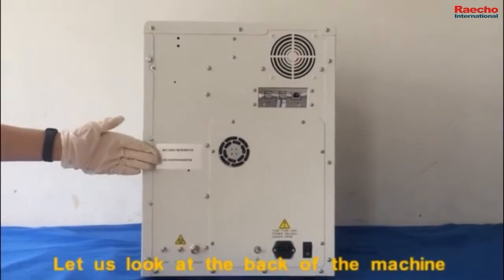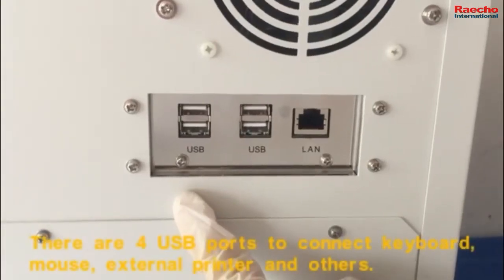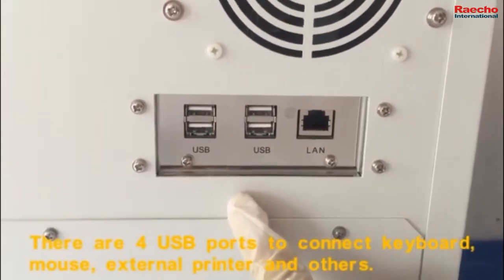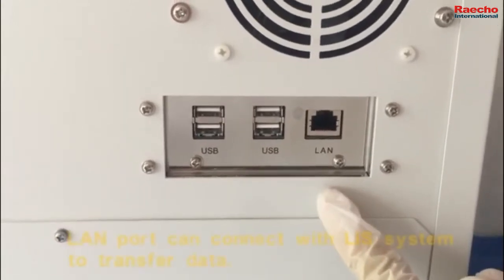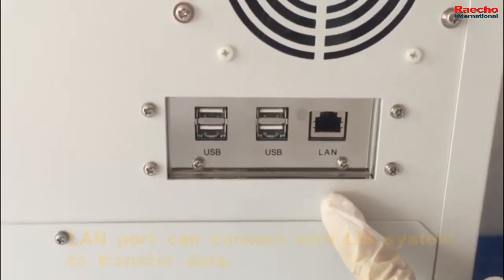Let us look at the back of the machine. There are four USB ports to connect with a keyboard, mouse, external printer, and others. One port can connect with the LIS system to transport data.